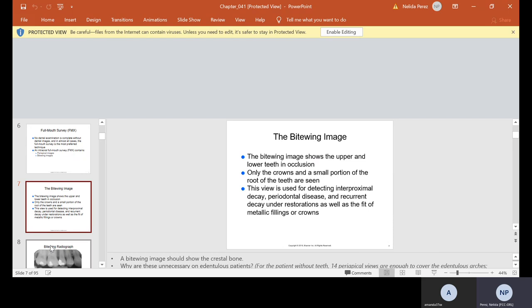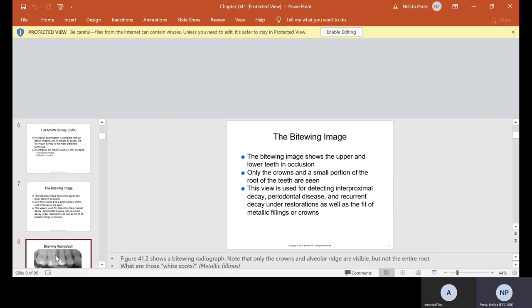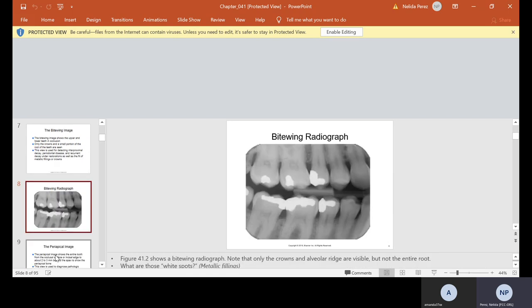A bite wing will also show the crestal bone. Here is an example of a bite wing. This x-ray shows premolars and molars — here's the maxillary and here's the mandibular. The white on these x-rays signifies amalgam fillings. We're actually going to start charting what we see on x-rays next week. So for instance, if I tell you what do you see on this x-ray, you're going to write occlusal amalgam filling.